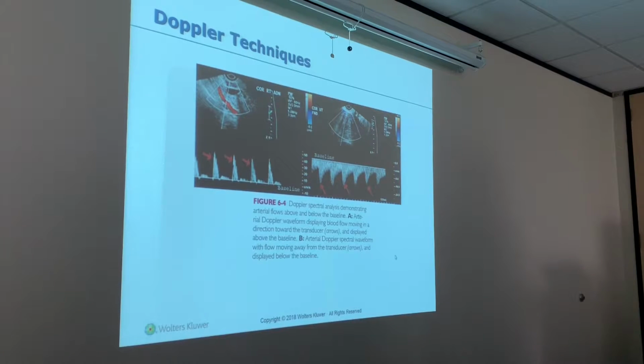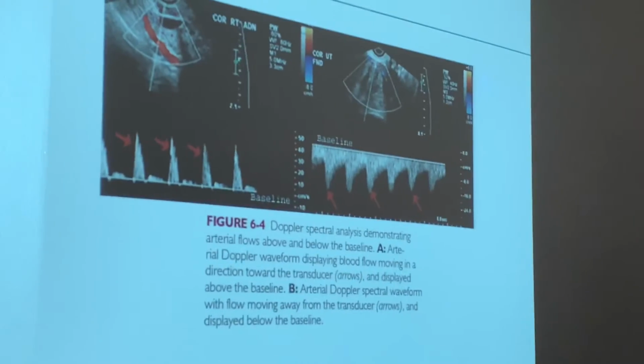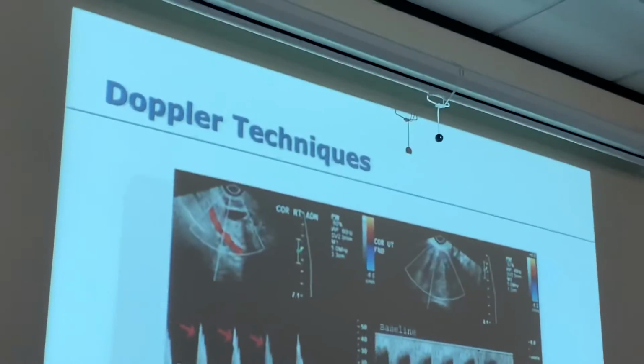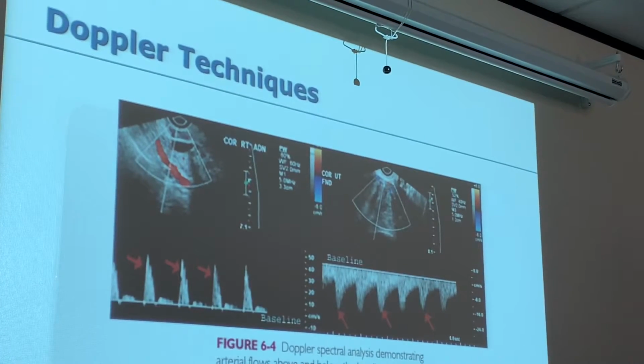Okay? Systolic, diastolic. Blood is going towards the transducer. My vessel is red. So if my sample gate is here, the blood is going towards my transducer. I can do a heel toe and make it just the opposite. I can operate that just by my hand.